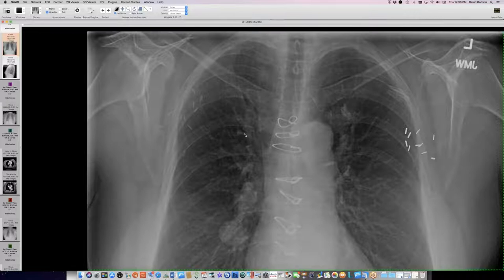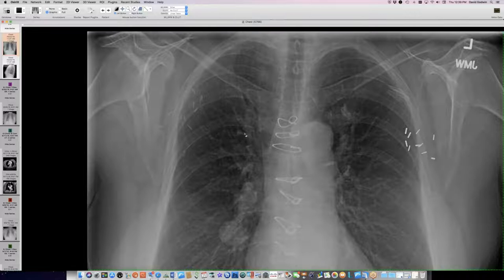These things are actually scarred into the tissue and it's hard to remove them — they pull the lead out through them, but the sleeve itself is really so anchored in tissue you'd have to do a sharp dissection to get rid of it. I think that's one of the best clues that the patient has had a heart transplant, because they sometimes forget to mention that in the order. It's very rare to extract a defibrillator and not replace it. So anytime I see internal wires removed but the suture sleeves remain, the first thing I question is whether they had a heart transplant — 95% of the time it's true.